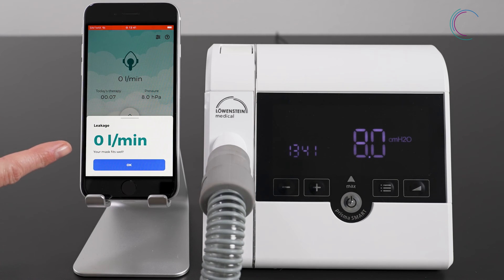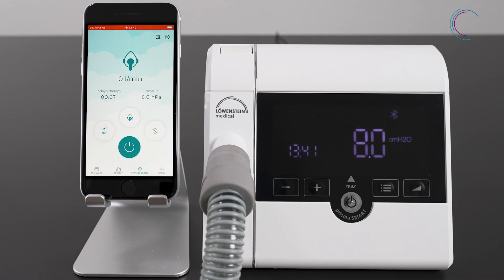After the 30 seconds, you will get feedback on your mask fit. In that case, your mask fits well. You can also interrupt the mask test anytime during the test. After stopping the mask test, your therapy will start.